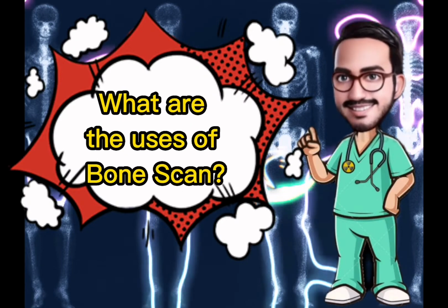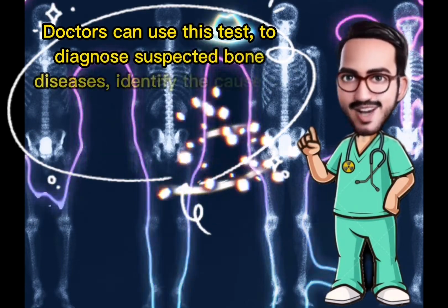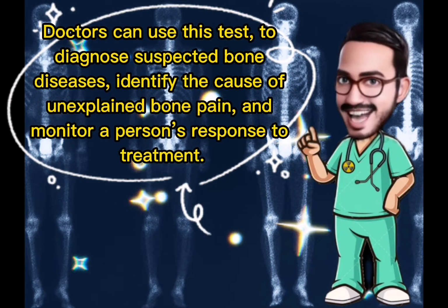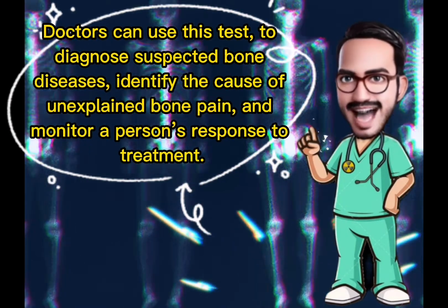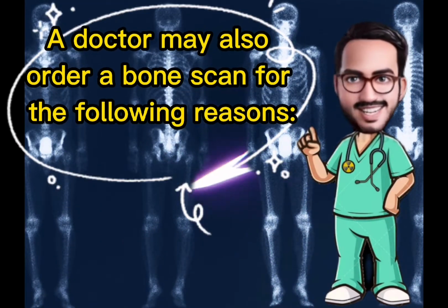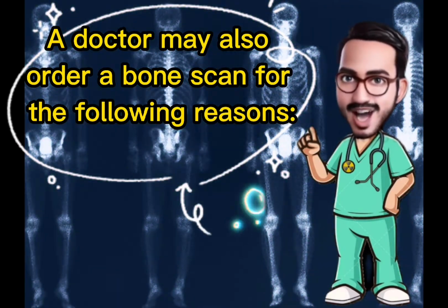What are the uses of bone scan? Doctors can use this test to diagnose suspected bone diseases, identify the cause of unexplained bone pain, and monitor a person's response to treatment. A doctor may also order a bone scan for the following reasons.